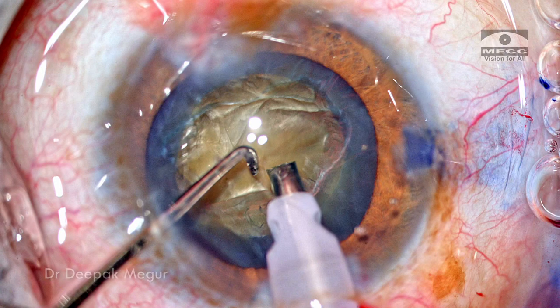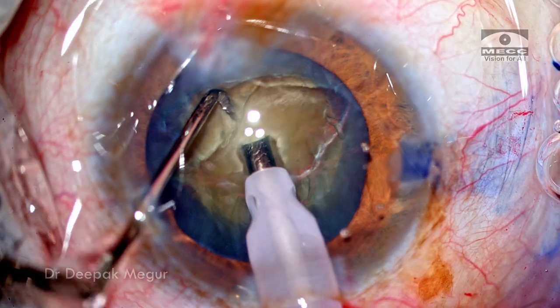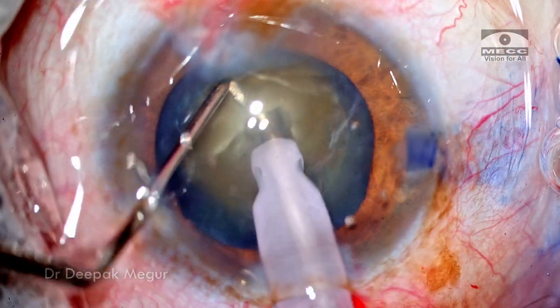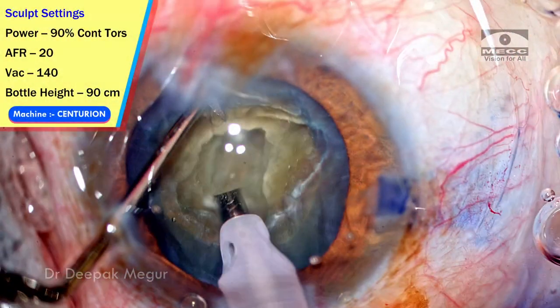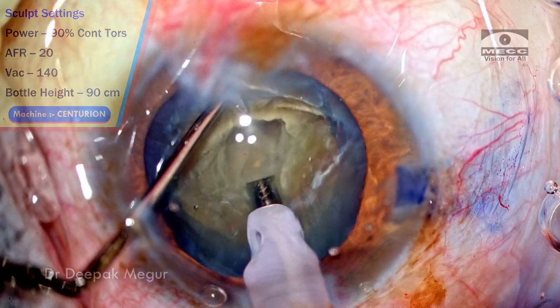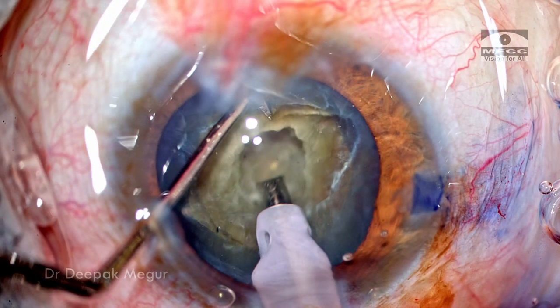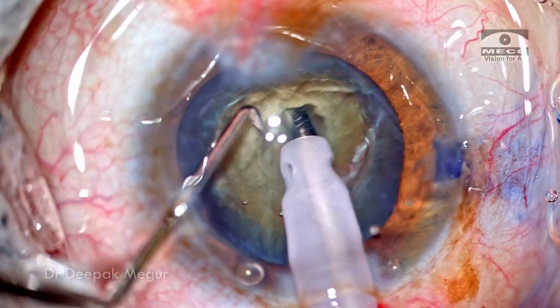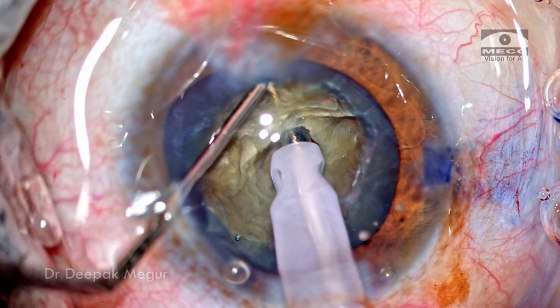The overlying superficial epinucleus and cortex is aspirated. Time to change settings to sculpt mode. My strategy is to create a small central pit before going on to chop the nucleus. For trenching I'm going to use continuous torsional power with very low vacuum and a very low flow rate. Once I've reached about 60% depth, I'm going to change settings to chop mode. The tip is buried using just the longitudinal energy so that it gives me a firmer grip.